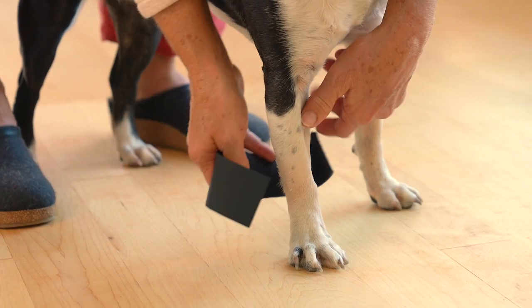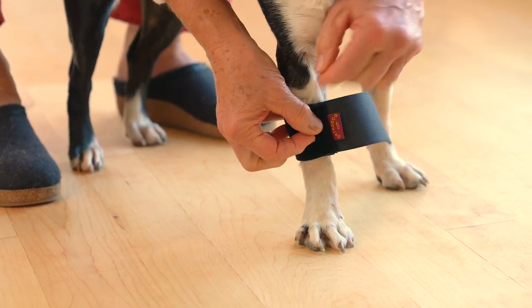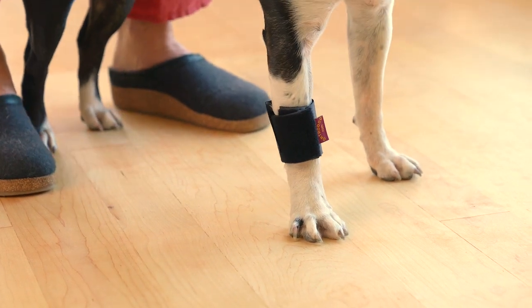To apply the OrthoDog Wrist Wrap, simply wrap the neoprene brace around the front leg about a half inch above where the wrist bends, and then securely fasten the velcro strap.